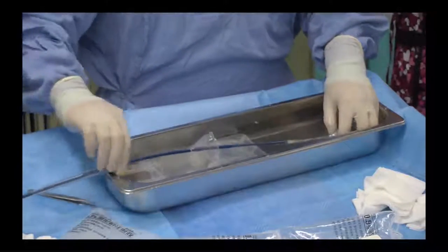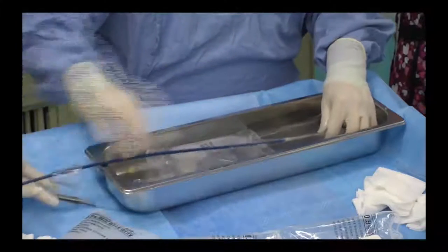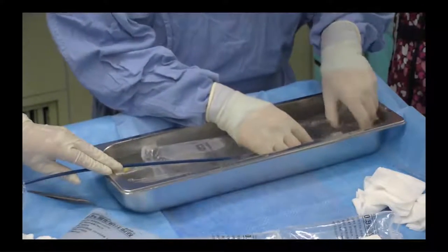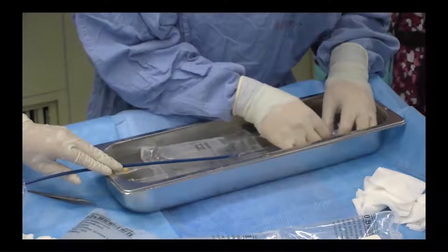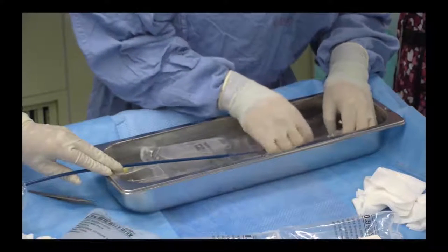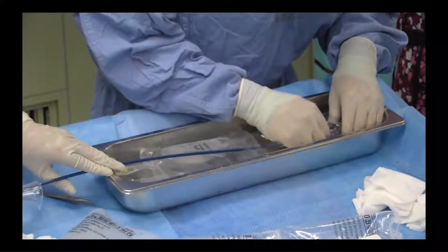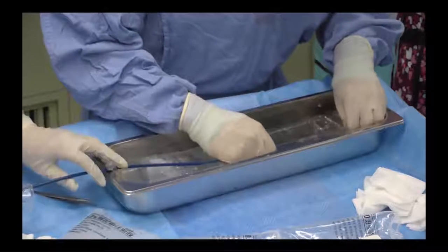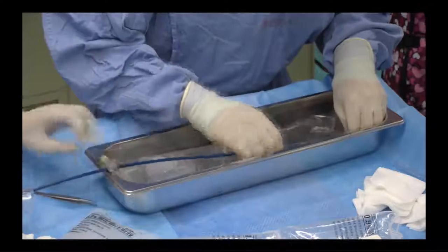So we had experience with the first in man with the Centera device almost 5 years ago, and I think the advantages are right now theoretical. You can have very tight tolerances, you can have catheters that incorporate metal elements in them, and it's a more controlled system. Possibly. When we move into other technologies, we typically build things out of metal rather than soft plastics. But I think it's still the infancy of this sort of system.